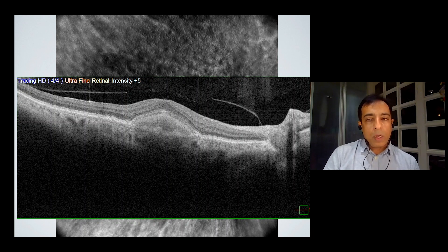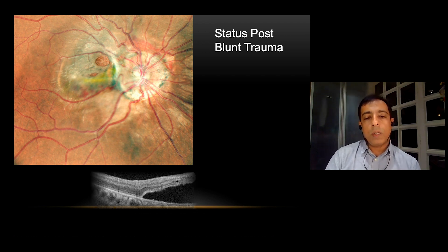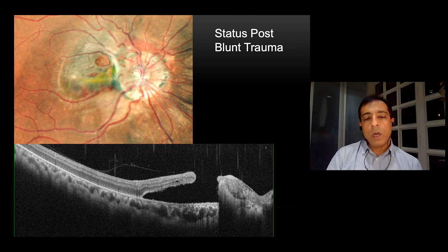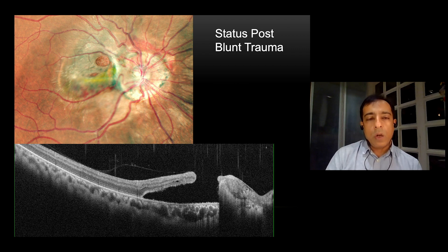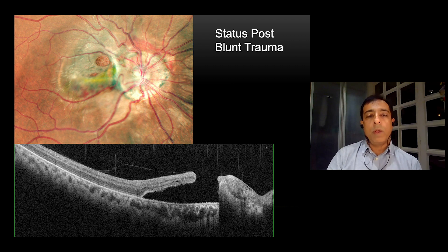A patient who came with blunt trauma — you see Berlin's edema and also a central hole just next to the disc which has formed. If you pass the OCT, it picks up exactly where the hole is: the retina ends temporal to the optic nerve head, and there's another hole below that. Again, multimodal imaging helps you document and explain to the patient — this is the hole you have, this is the extent of the condition, and hence the prognosis can be explained very well.